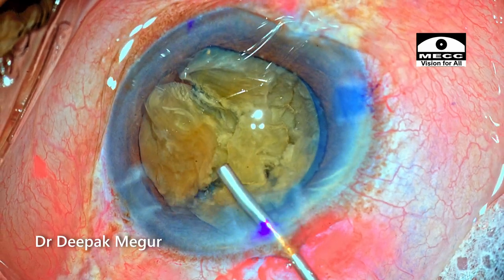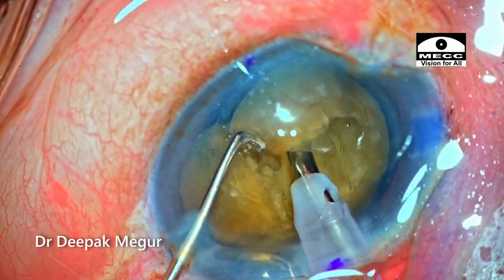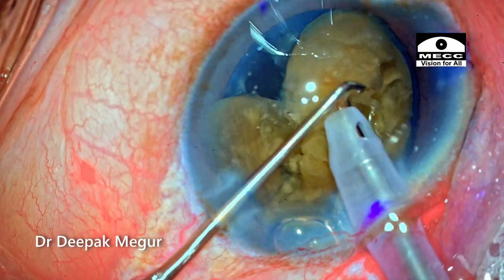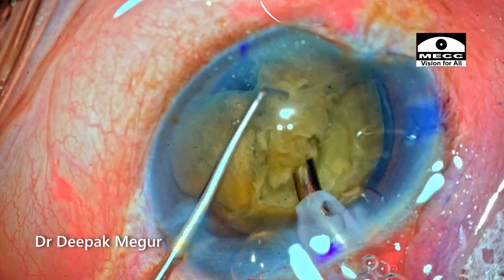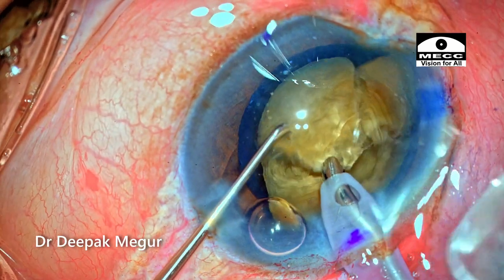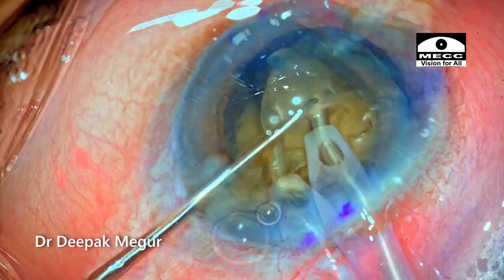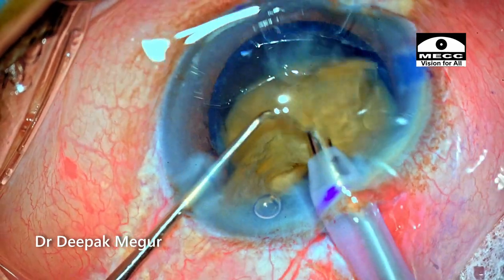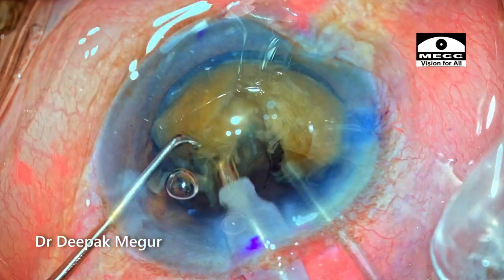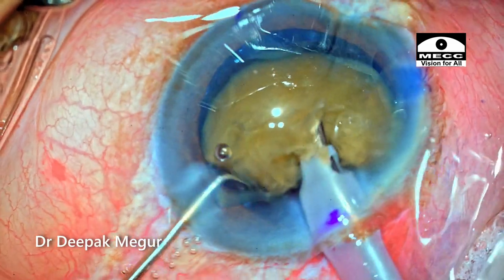I go back, inject viscoelastic, and wait for the patient to settle down. The small central part of the endonucleus is freely floating and emulsified with ease, but some other pieces — the posterior plates — might still be held together, so I need to be conscious of this. After emulsifying a fragment, I replenish the eye with more OVD. I find it a little tricky to separate the last few attachments holding the two fragments of the heminucleus.